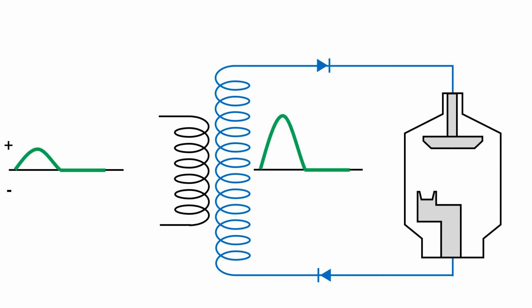Altogether, the graph of a half-wave rectifier looks like this. Notice that the graph is only using half of the full wave. This is because only half of the electrons provided are being used. If our X-ray machine is only using half of the electrons provided to it, then our techniques are only half as strong as it would be if all electrons were used.